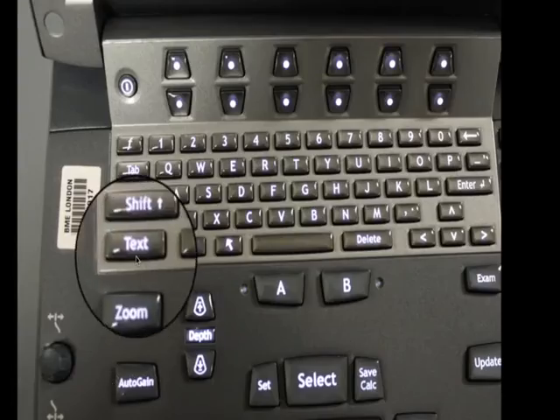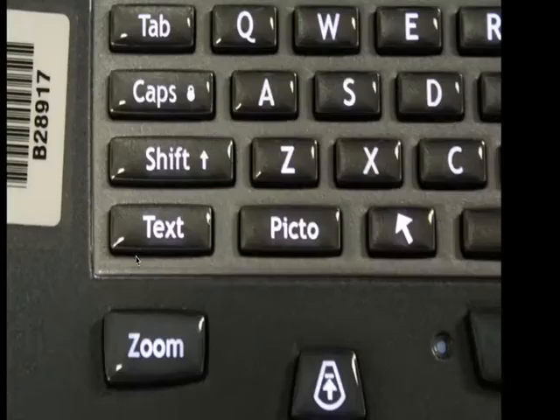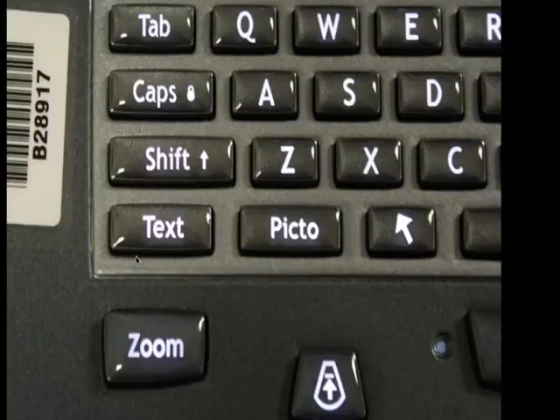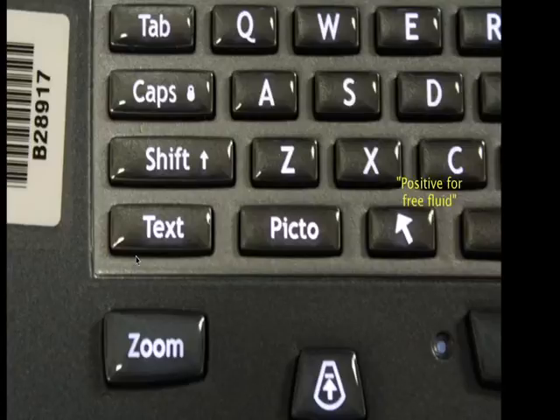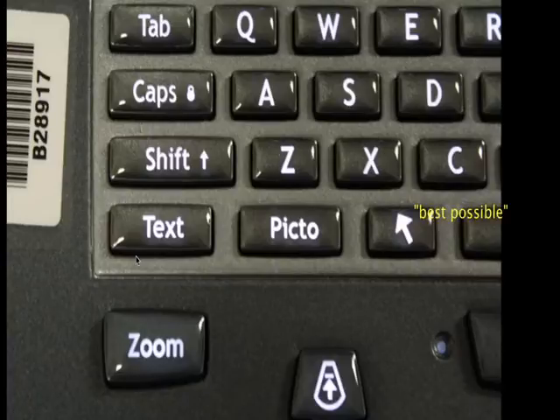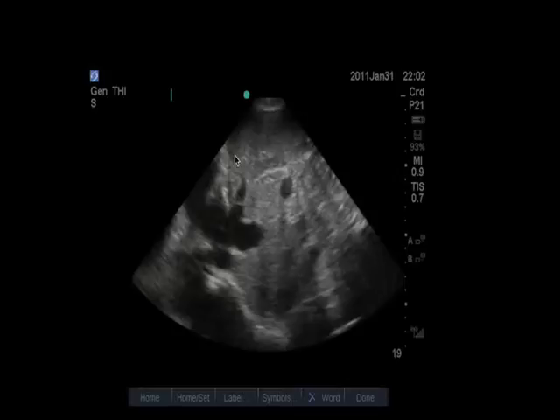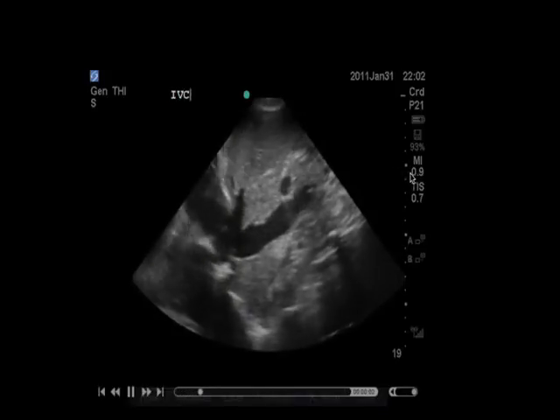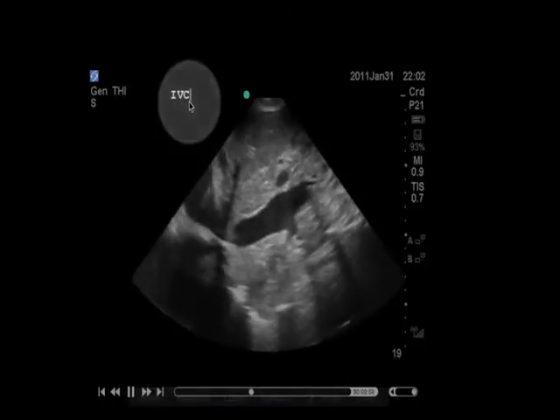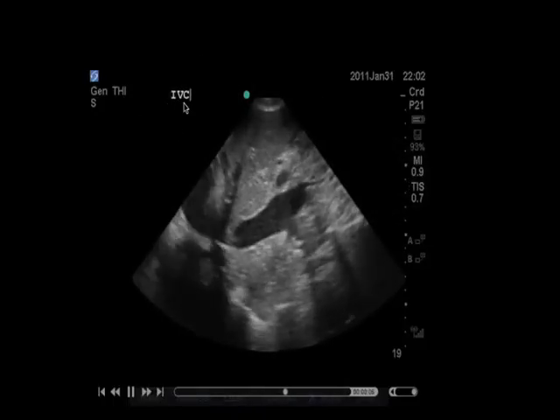There's a text button at the bottom left of the keyboard — press this at any time and that will mobilize a cursor on the screen display. You can then type freely anything to do with the findings, such as 'positive for free fluid,' 'indeterminate,' 'best exam possible,' or any other descriptors you think might be helpful, such as the mechanism of injury or anything else relevant to the exam. We can see here what it looks like as this was typed during a clip being saved of the IVC in this patient.